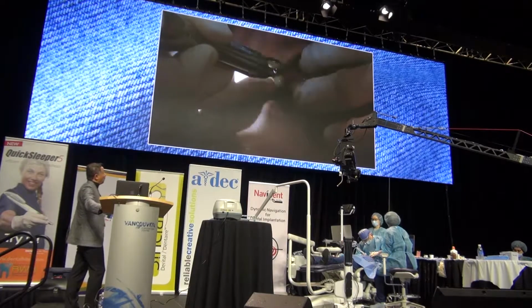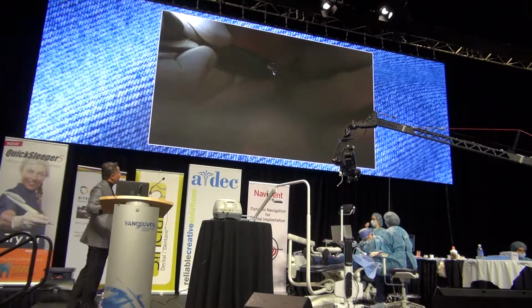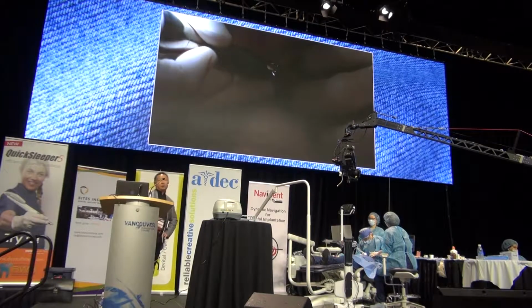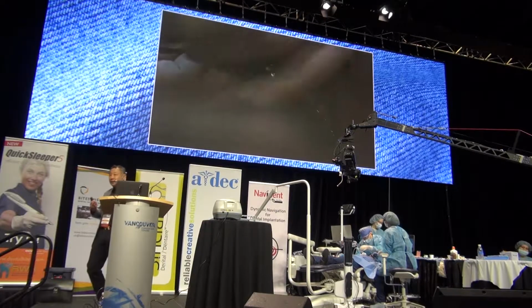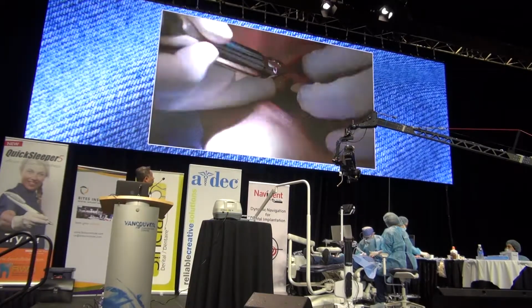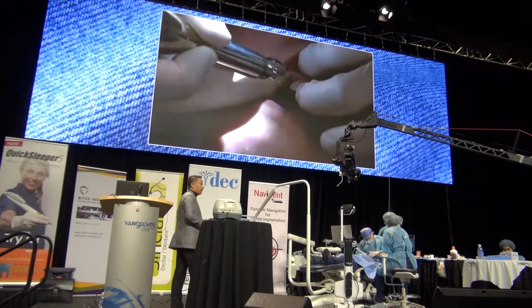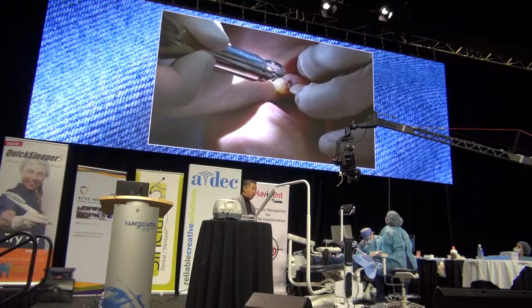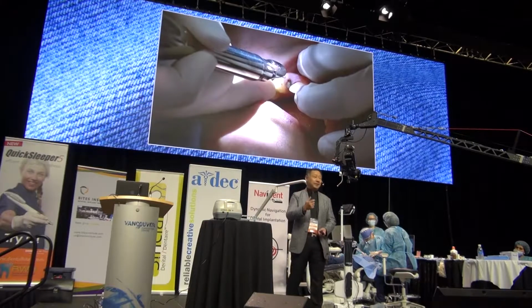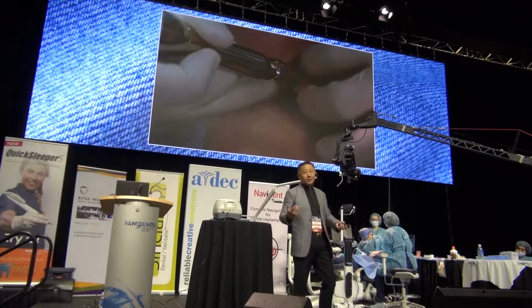Once you've penetrated the cortex and you're into the spongiotrabecular bone pattern, he hits another foot pedal, and it slowly dispenses the local anesthetic. Now, I've done this enough to let you know it does take time, and the patients don't feel anything, and time is the critical thing. You remember the rate of injection is proportionate to the amount of discomfort. So this is regulated and controlled. It does go relatively slow, because you and I as dentists were taught to inject one carpule, 1.8 cc, over up to a minute. You and I know we don't take a minute, because a minute standing by the patient is an eternity.